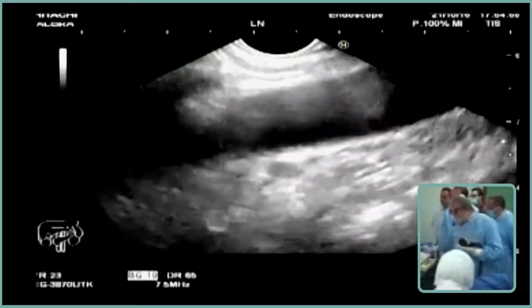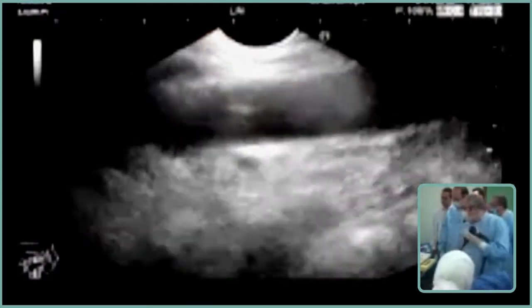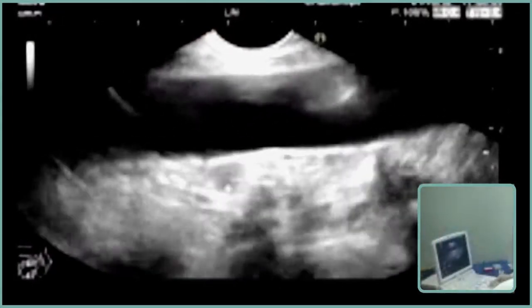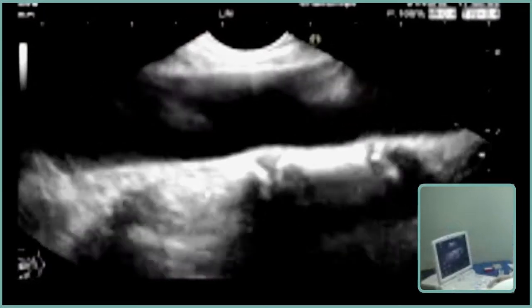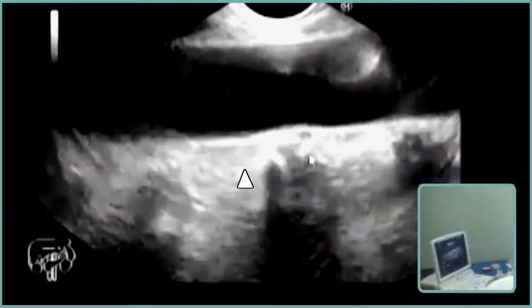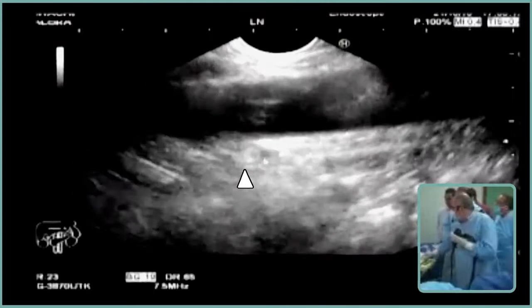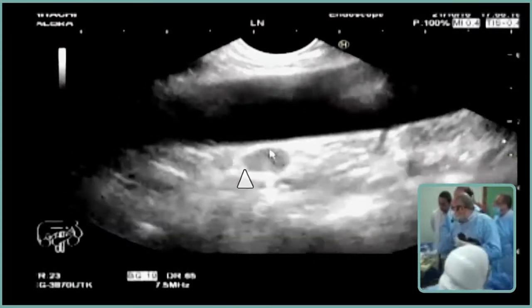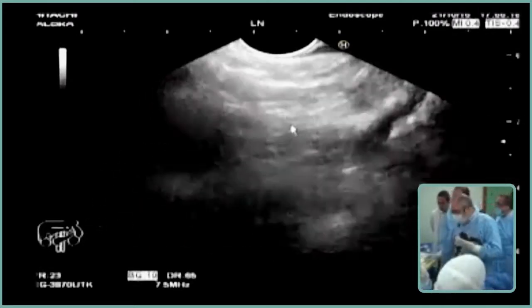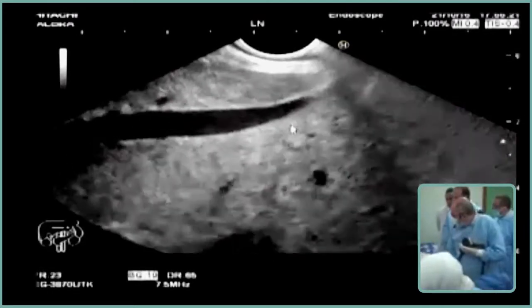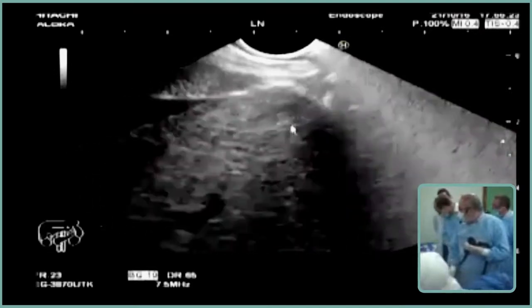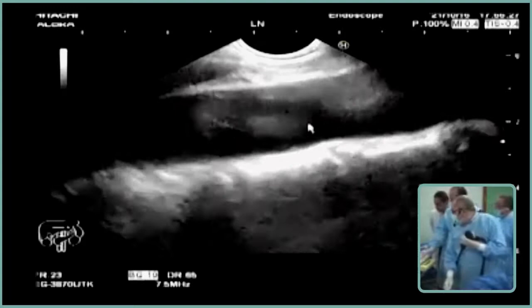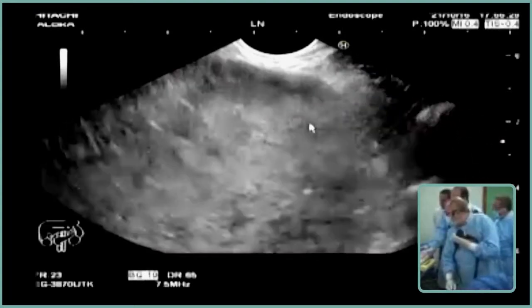Now we will study the mediastinum. There is a lymph node retro-aortic, and it's very dangerous because it is almost always pathological. This is the vertebral column, and this is a lymph node — although small, it is malignant-looking and very dangerous. I will study the mediastinum to choose the best lymph node, large and malignant-looking, to sample it.